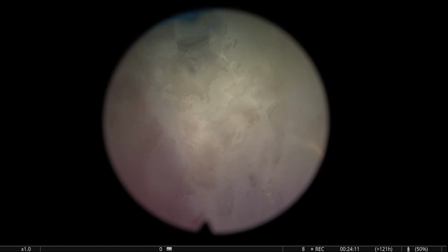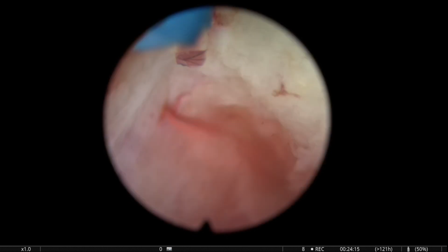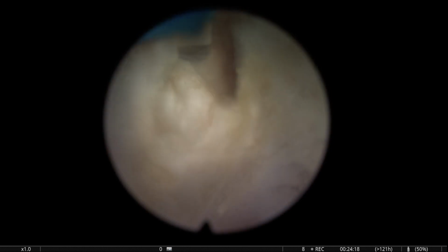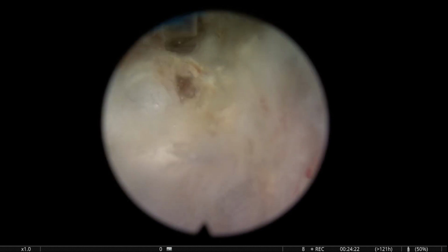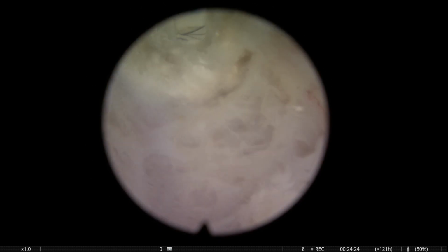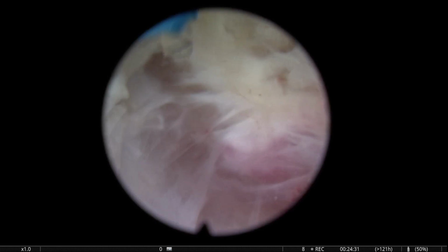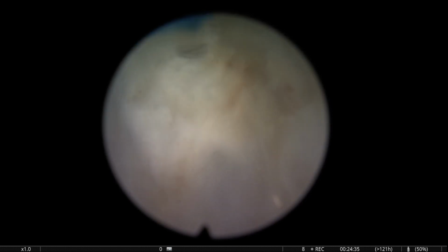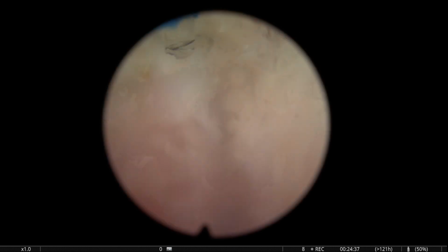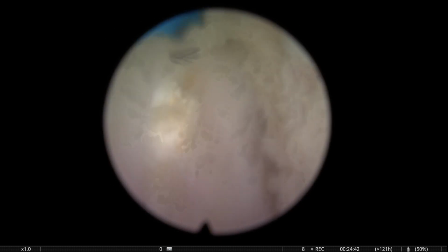That will not penetrate in the capsule, and it will allow you to dissect these planes even when the capsule is totally perpendicular to the fiber. The energy will be used to cut the fibers that attach the adenoma to the capsule, but there will be very little energy hitting the capsule with enough ability to cut it or open it or perforate it.